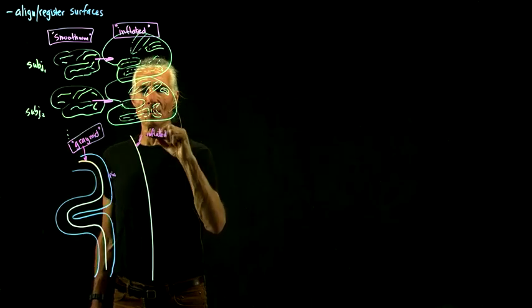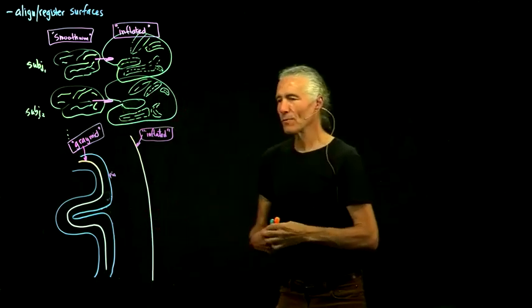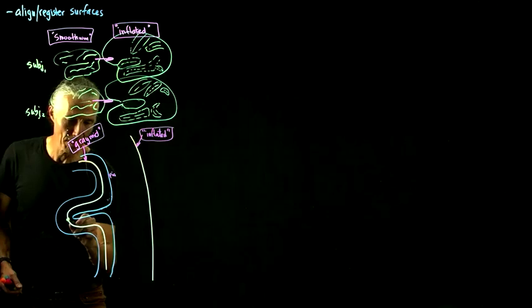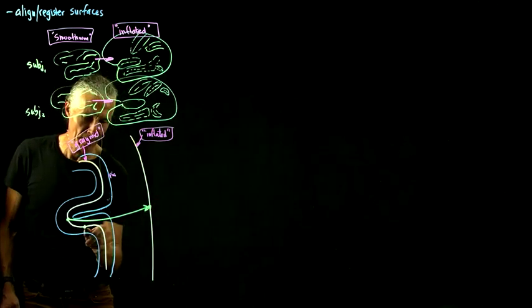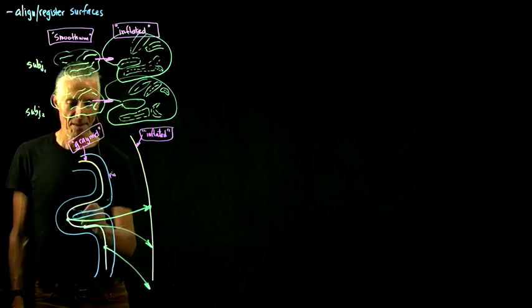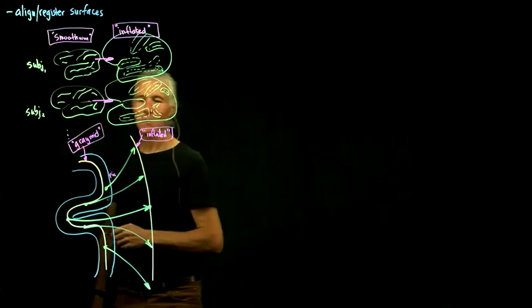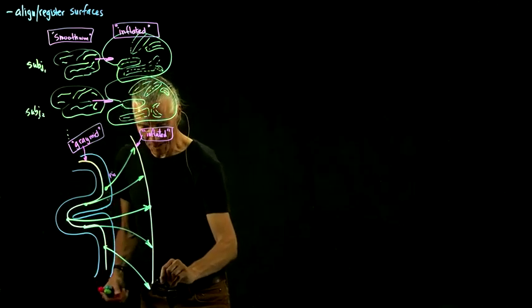So what will happen when you look at individual vertices? Well, this guy down here is going to come up to here, and then this one is going to go out to here, and this one is going to go over to here, and so on, something like that. So all you have to do, the one line of code, is just measure how much you moved.